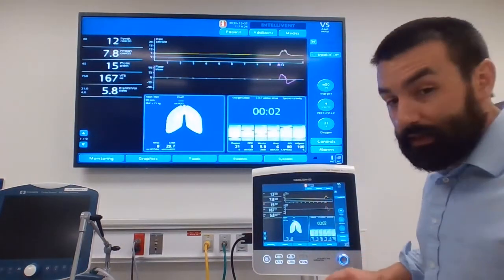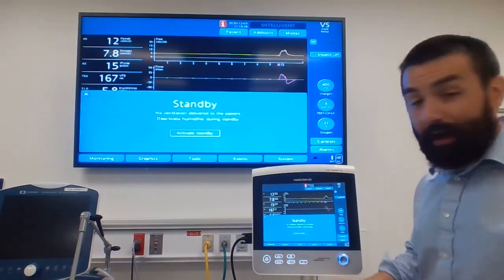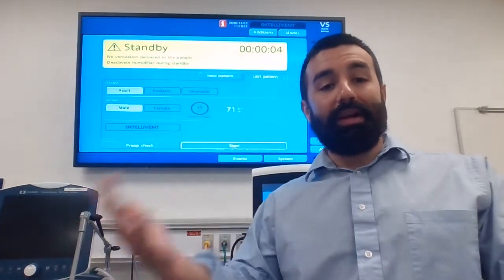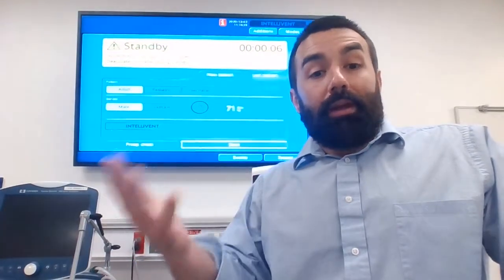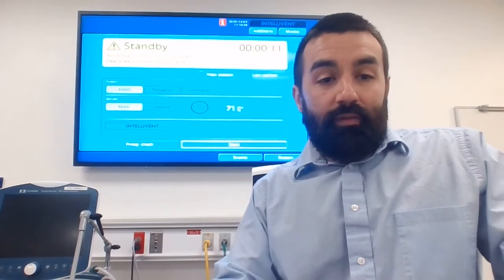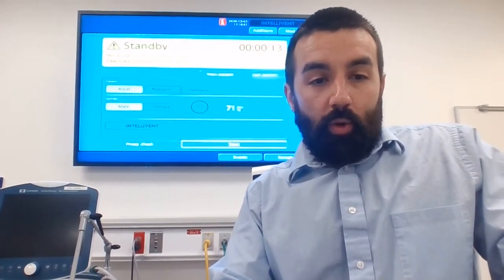So I'm going to stop that video here. I'm going to go ahead and put this in standby, and I hope that helps. Once again, volume support is essential because it is the spontaneous application, and it would be the same for the spontaneous breaths as we get into ASV on the Hamilton ventilator series. So hope that helps, guys.